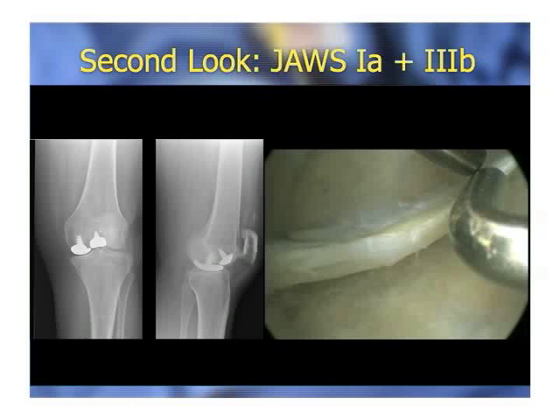And in fact, what I'm hearing in Europe and some other countries that have had the opportunity to do second looks is that they're finding the same thing. Wherever the implant is recessed, we see cartilage overgrowth. In this case, it's anywhere from 3 to 5 millimeters, but wherever the implant's recessed, we see that on a consistent basis. And I've had three cases where I've had to go back, two for the fat pad impingement, one was for lysis of adhesions, and we've observed this.